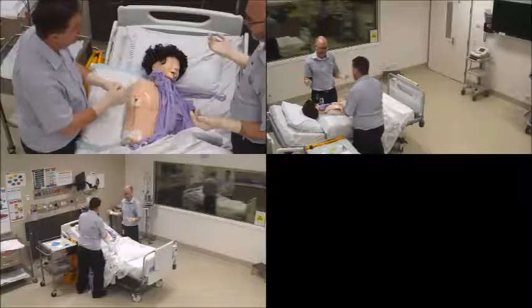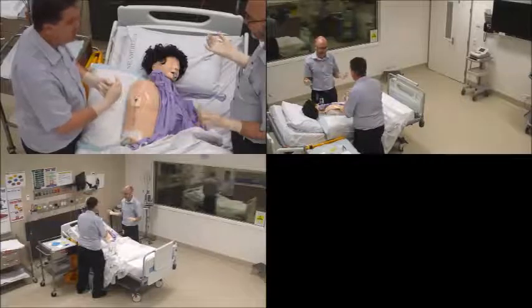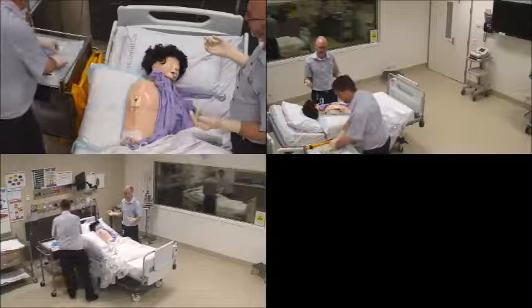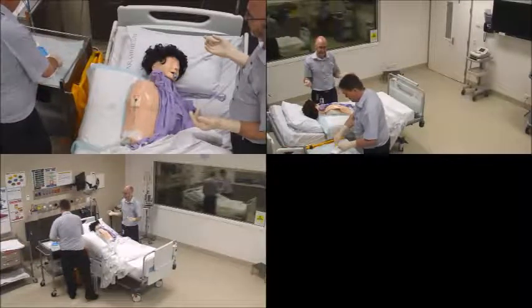Yeah. Okay? Now the length of time that you've just held your breath for is about the length of time that the whole process should take. Okay? Have you got any questions? No? Okay. So I'll just give this a quick dry off.